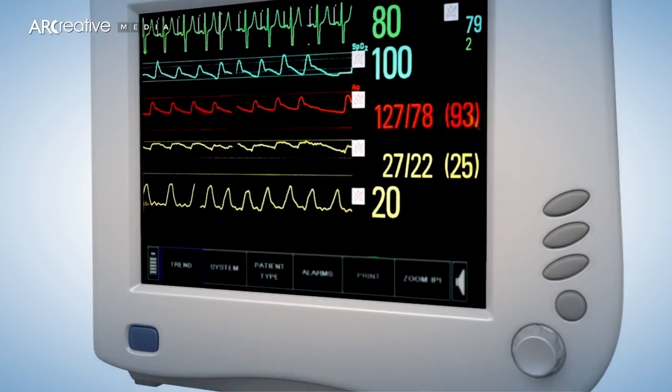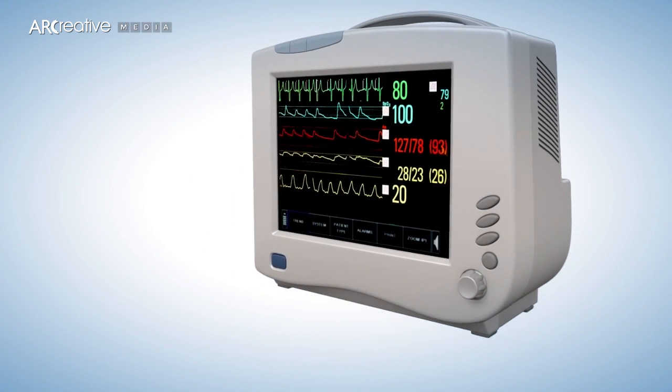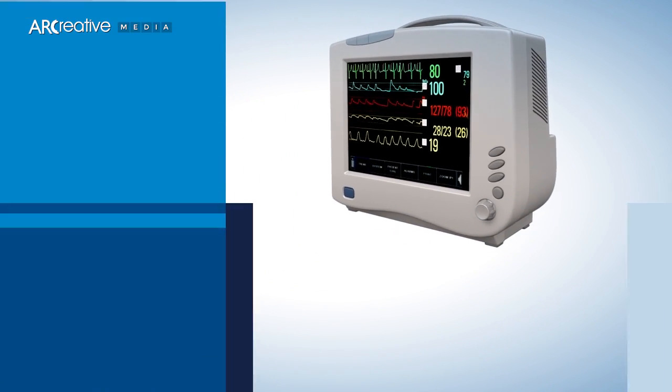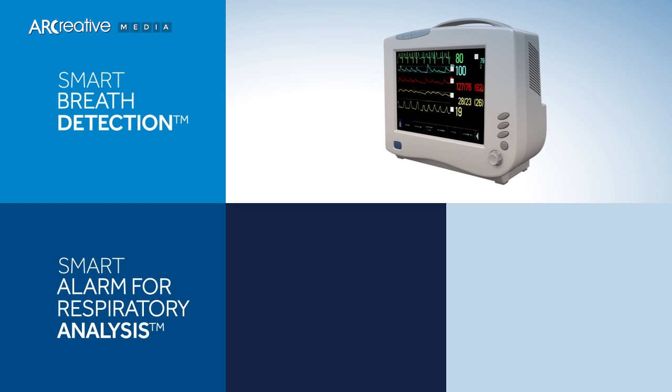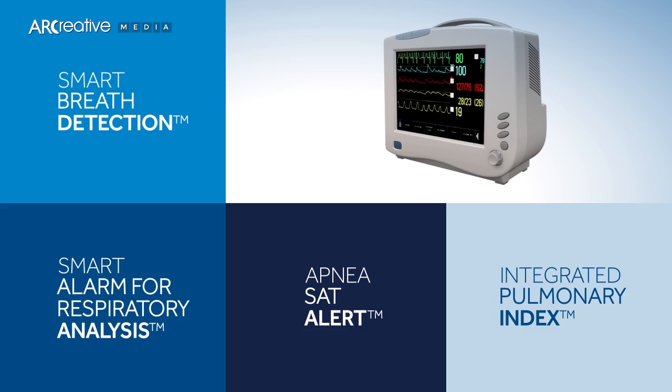Compared to standard end-tidal CO2 monitoring, Microstream capnography offers clinicians additional benefits with smart capnography algorithms, including smart breath detection, smart alarm for respiratory analysis, apnea sat alert, and the IPI integrated pulmonary index.